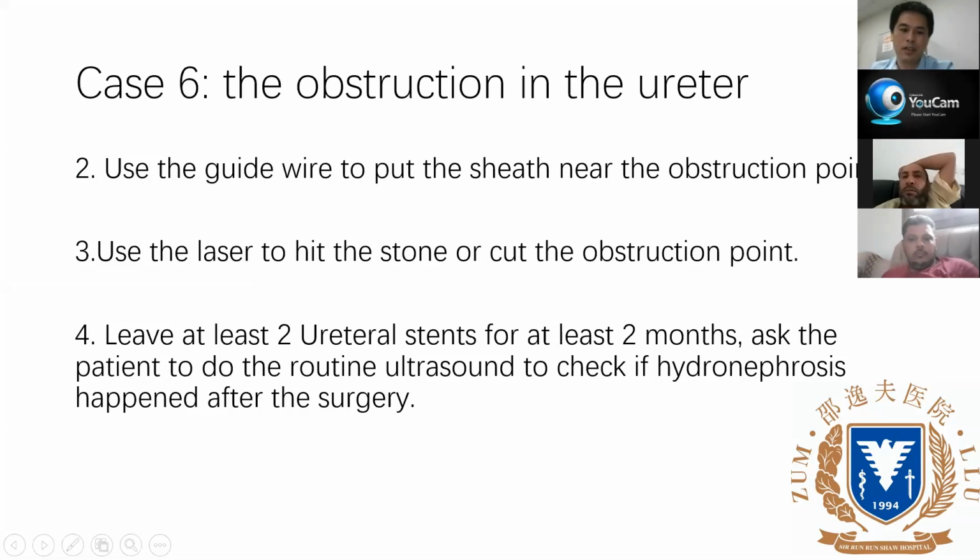And the last step is you need to put at least 2 ureteral stents for at least 2 months and ask the patient to do routine ultrasound, like Dr. Wang said, at 1 month, 3 months, and 6 months, in case hydronephrosis happens after the surgery.